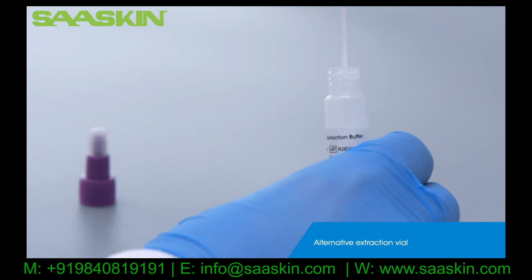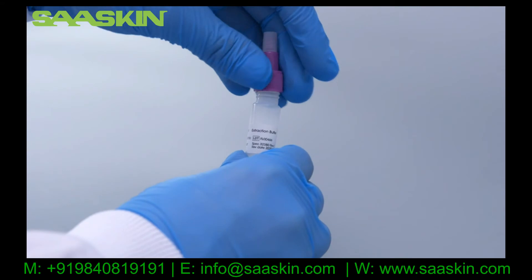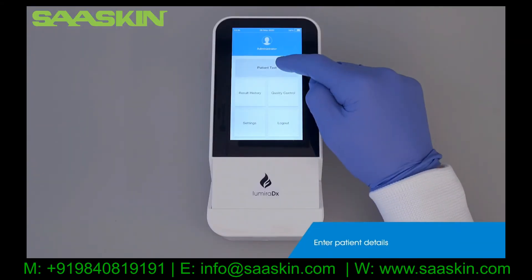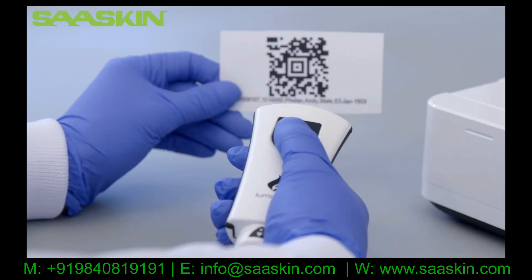If your test kit comes with a purple capped extraction vial, follow the same process to prepare the patient swab sample. Select Patient Test, then enter the patient's details using the keypad or the barcode scanner.